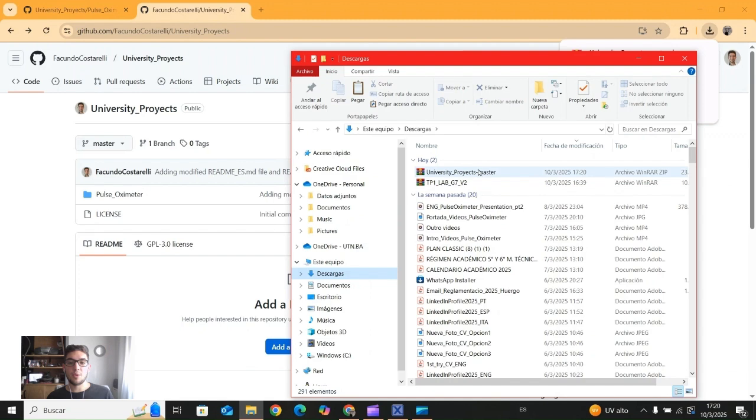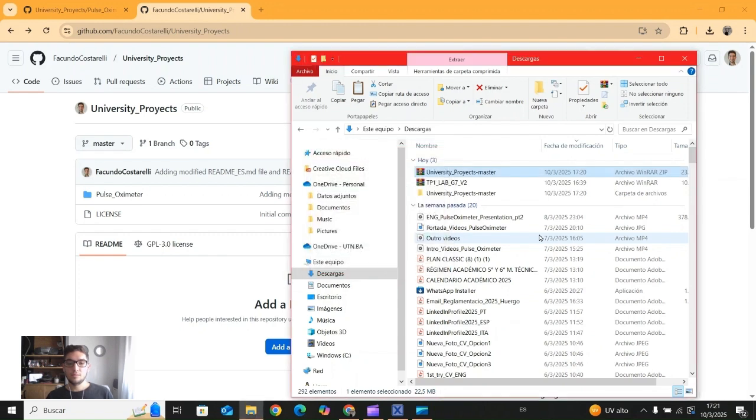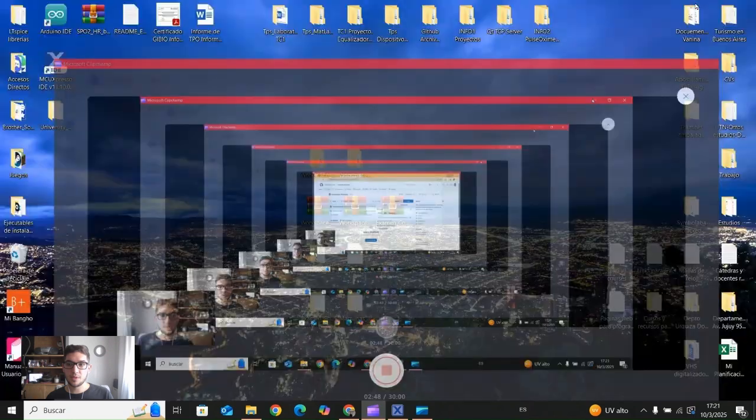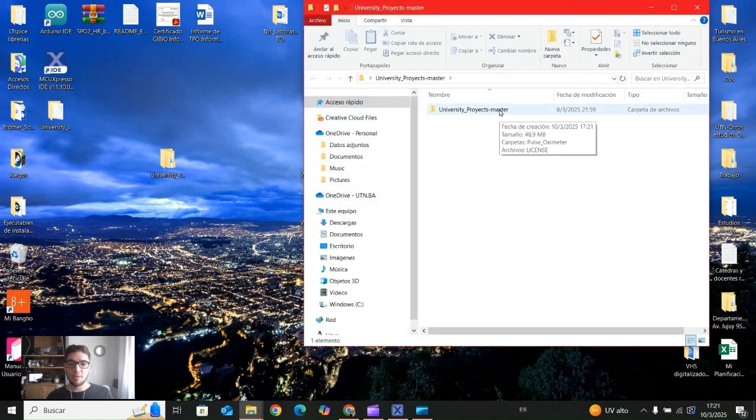We have it here, University Projects Master. We extract it in a folder with the same name as the zip. Now we can, for example, move this folder to the desktop just to follow the same steps that I was mentioning before. It really doesn't matter where you have this folder, since you're going to import a zip file. You're going to import a zip file, so you don't really need to worry about this.